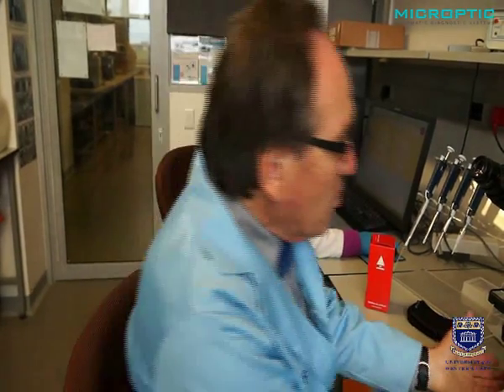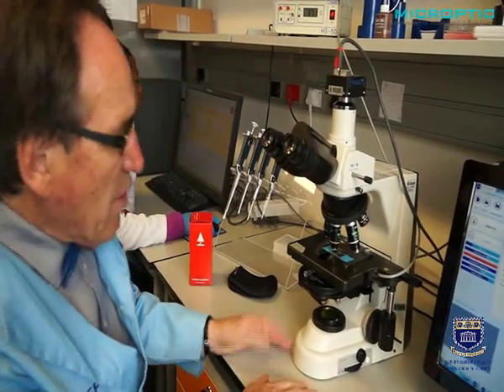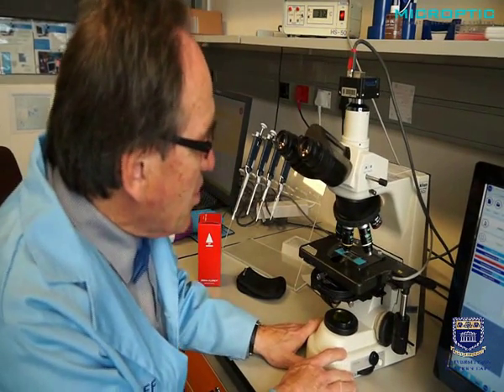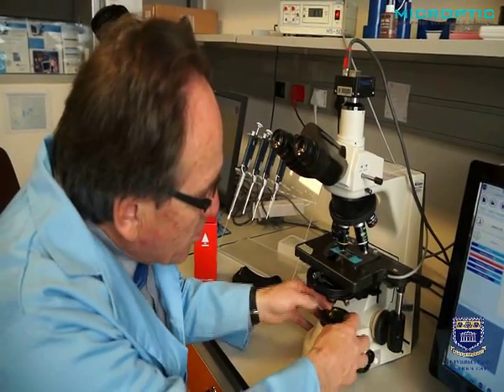Okay, now that I've shown you the basic requirements for a CASA laboratory, which is indeed very simple, but one must be very thorough about it, we can go into the details of specifically computer-aided semen analysis. And let's start off with the details of the microscope. So we're going to concentrate here on all the components that are required, really. So one needs a really good, solid compound microscope. In this instance, I'm using a Nikon E50i microscope, and it is fitted with, first of all, a very good halogen source.